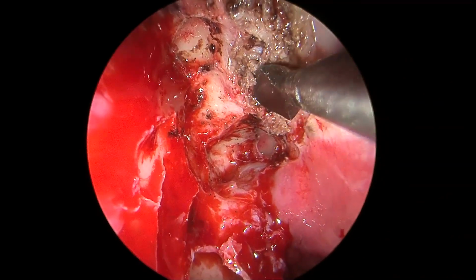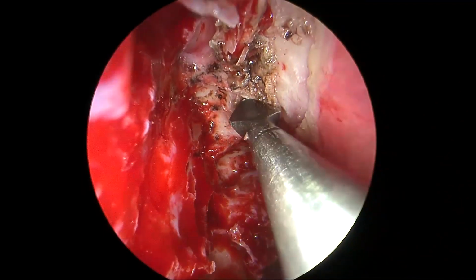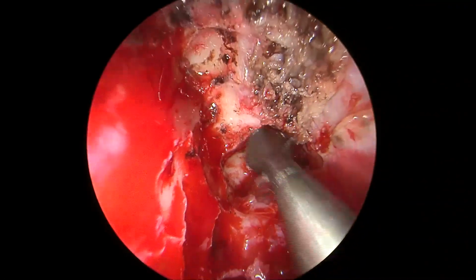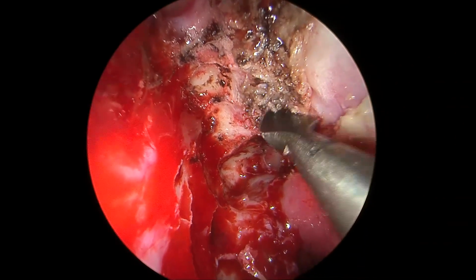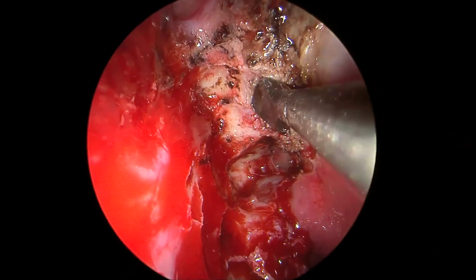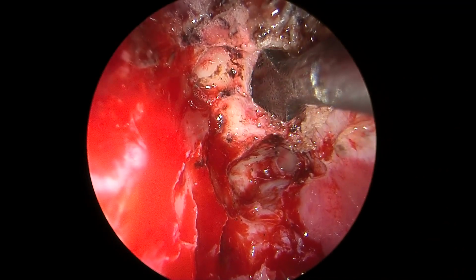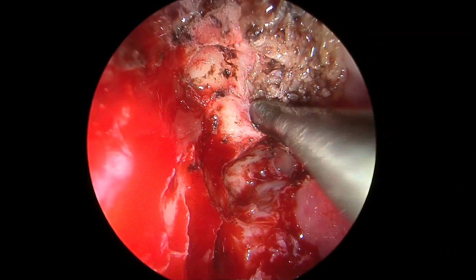So we prefer to do this, and now you see how we can simply palpate the defect by taking our Mason's elevator, the sharp end of it, just between the dura and the bone, to see that we have just slightly undermined, and that's good enough. More undermining is normally required in situations where we use fascia directly over these defects. But since we are using fat, a broad recognition of the bone defect is good enough. You see here how the elevator just goes in a layer between the dura and the bone to acknowledge the defect over which the fat will be kept.